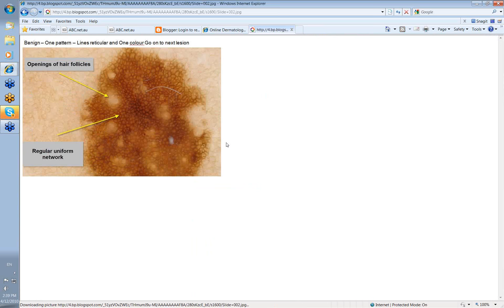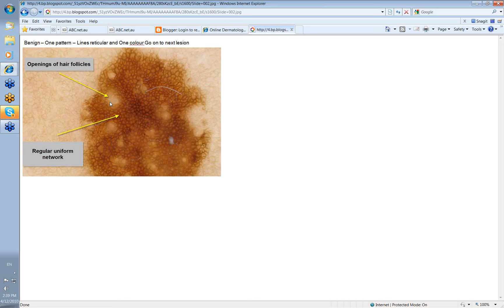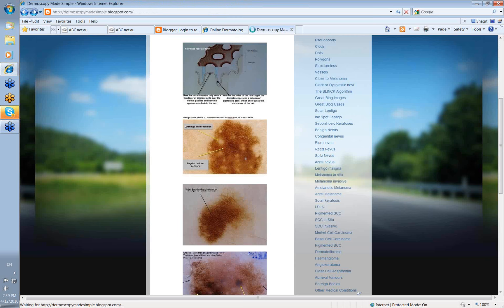So let's look at some examples. There's a benign lesion, one pattern, lines reticular, one color, brown. Okay, go on to the next lesion. These are just the openings of hair follicles where there's a little hole in the pattern.